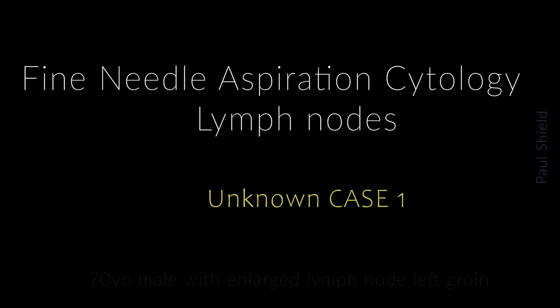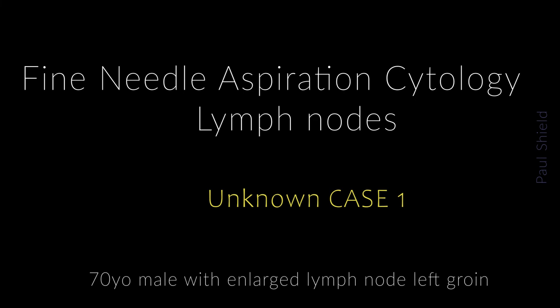So this one is FNA of an enlarged lymph node in the left groin in a 70-year-old male. We were given no previous history on this patient.